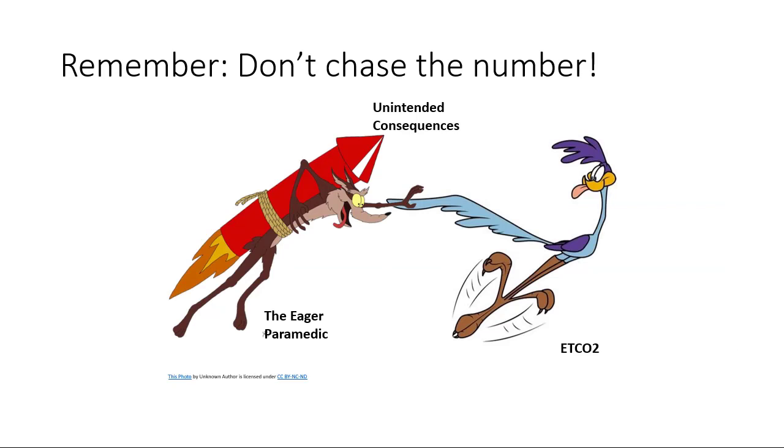We used to teach paramedics that we want an ideal end-tidal CO2 of 35 to 45. Say we have somebody that's been down for 3 hours in not true respiratory arrest, but definitely hypoventilation, and their end-tidal CO2 is really high. We used to have paramedics think, oh, I need to bag that down.